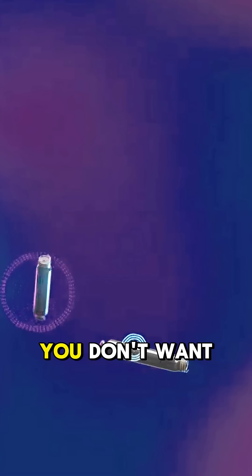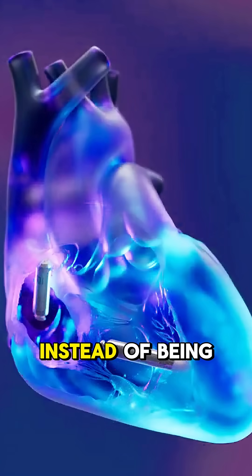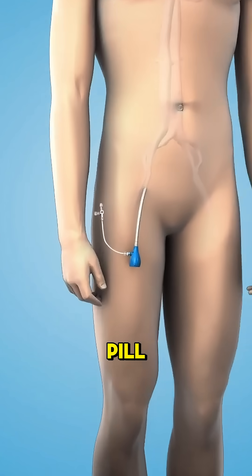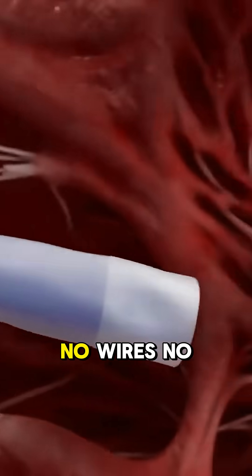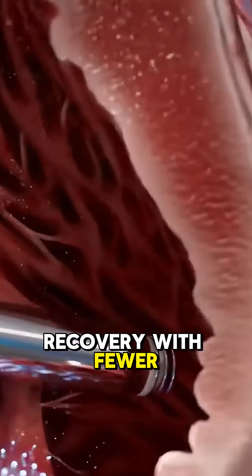What if you don't want wires at all? That's where the leadless pacemaker comes in. Instead of being placed under the skin, this tiny device — about the size of a vitamin pill — is inserted through a vein in the leg using a catheter and placed directly inside the heart. No wires, no visible scar, and a faster recovery with fewer complications.